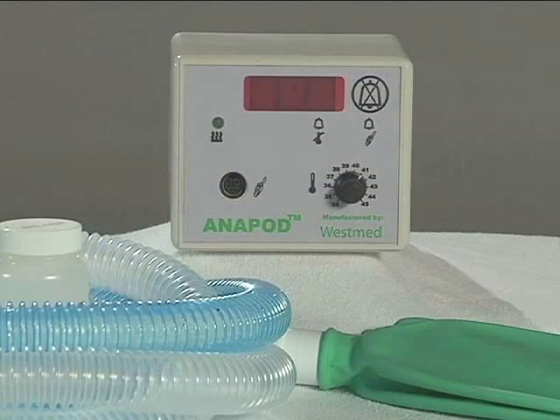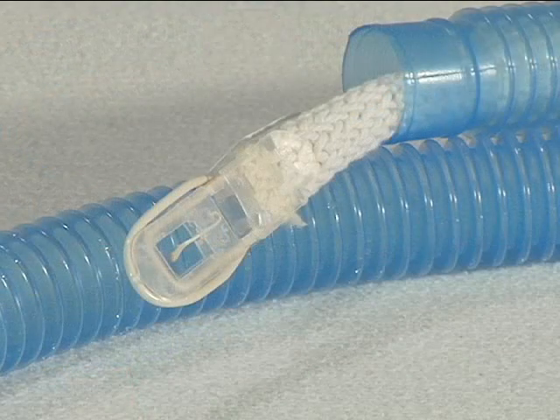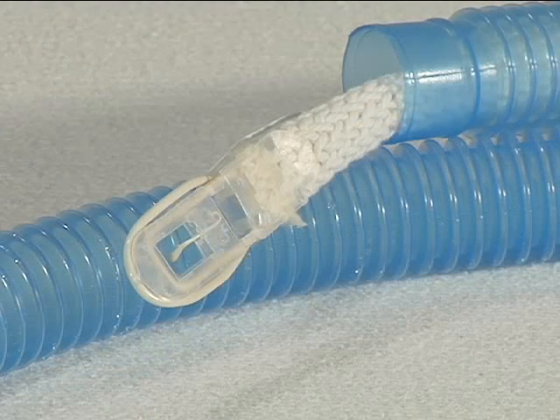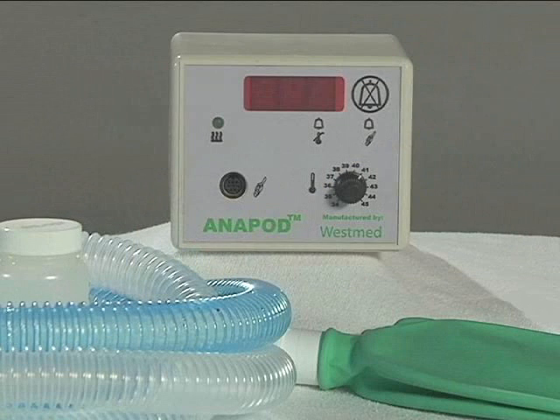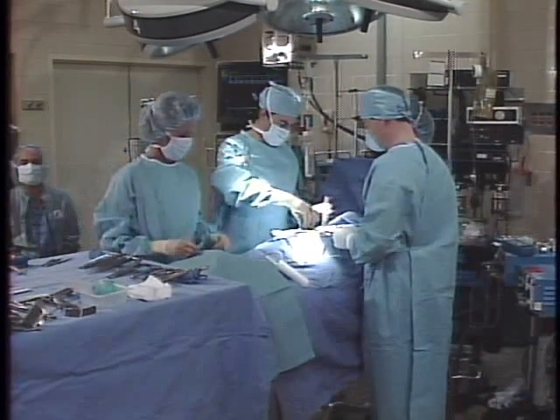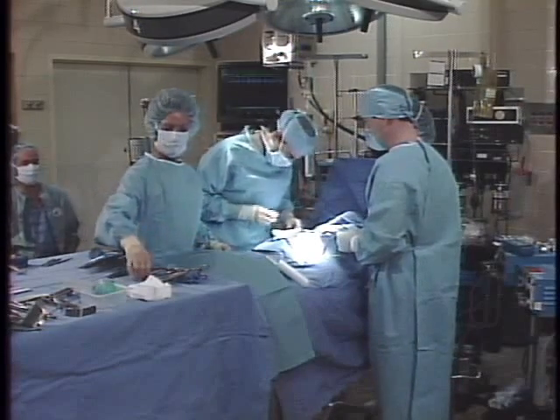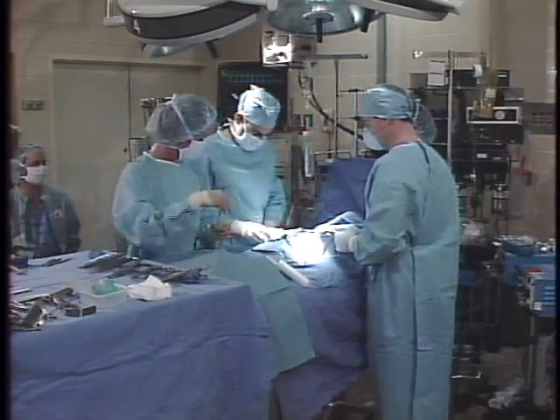The Anapod humidification system and associated breathing circuit is a wick-type anesthesia heated gas humidifier system intended for use in a hospital operating room setting to help maintain normothermia during surgical operations without complex, bulky, and more expensive methods — especially when passive warming methods are not sufficient and active methods such as warming blankets and forced air warmers are expensive and impractical for certain procedures.